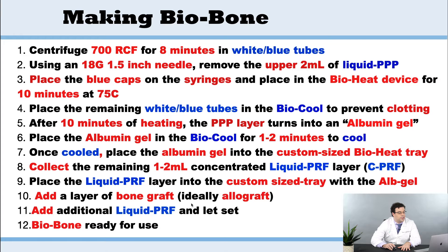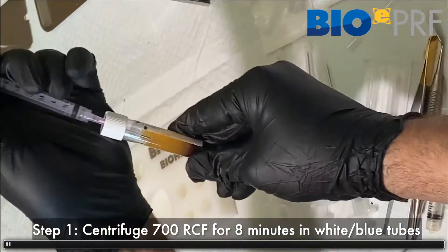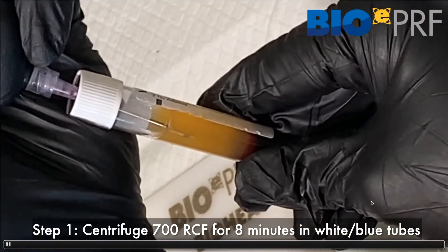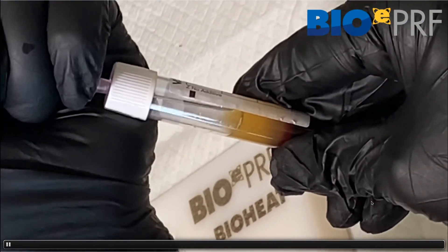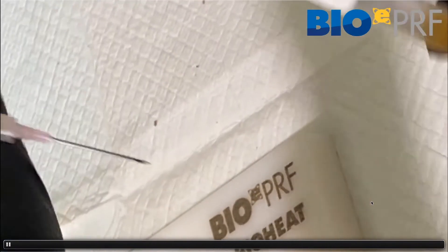Now what's different is we're going to add the allograft. So add one layer of the allograft bone, and then a little bit more liquid PRF — that's what's going to make the sticky bone over top of the EPRF membrane. The advantage of this technique is that you're making a sticky bone with the outer extended PRF membrane built into it. We're going through the protocols, and I'm sharing the exact same videos on purpose so that people know it's literally exactly the same steps.